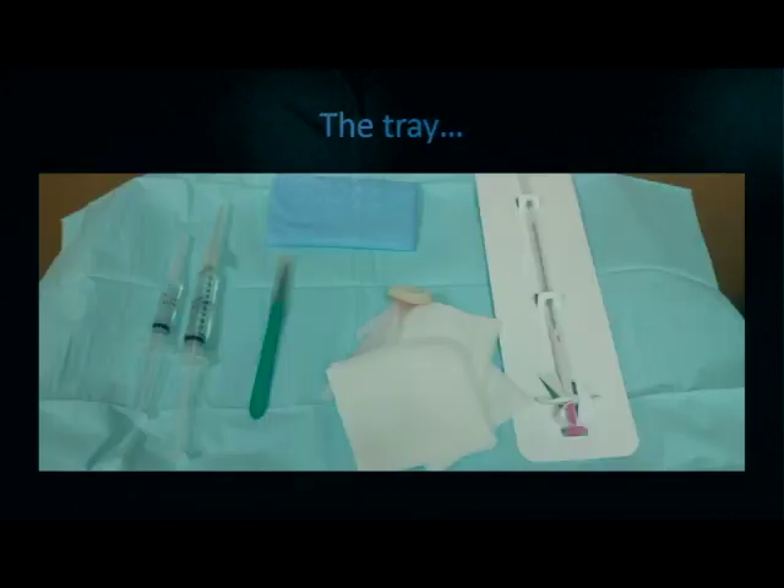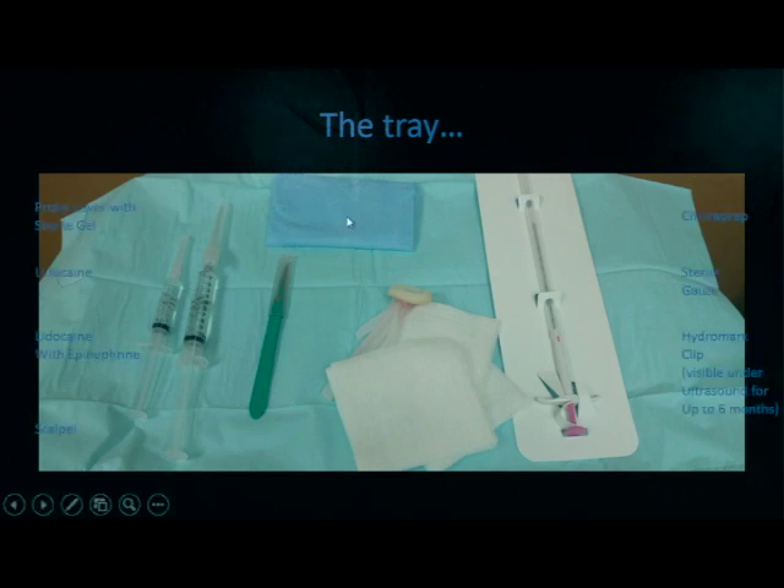Here are some of the basic items that you'll see on the breast biopsy tray. We have a probe cover with gel, lidocaine, lidocaine with epinephrine, a small scalpel, a device used to help clean the skin, as well as some gauze, and your biopsy needle.